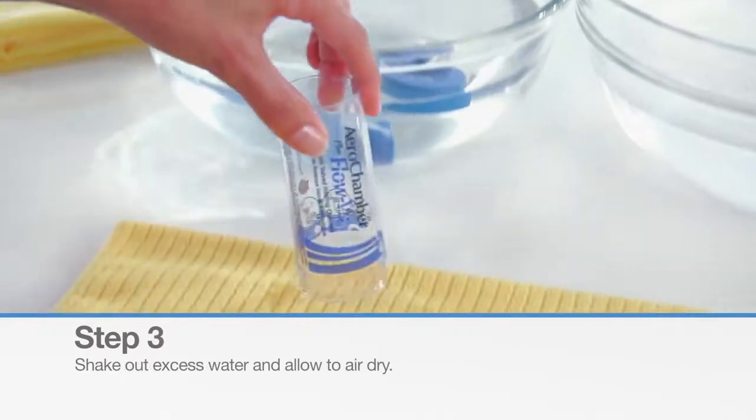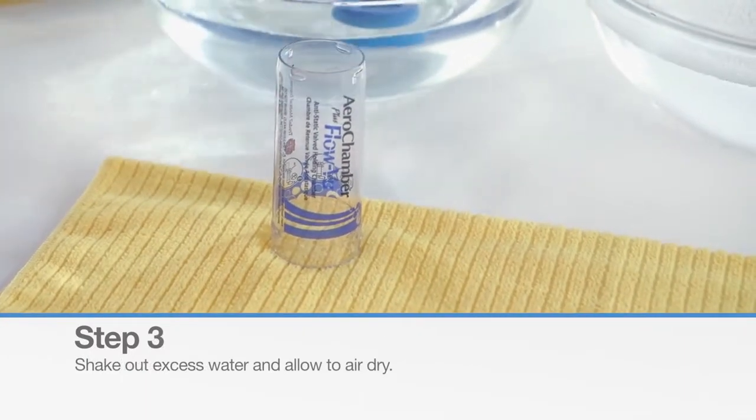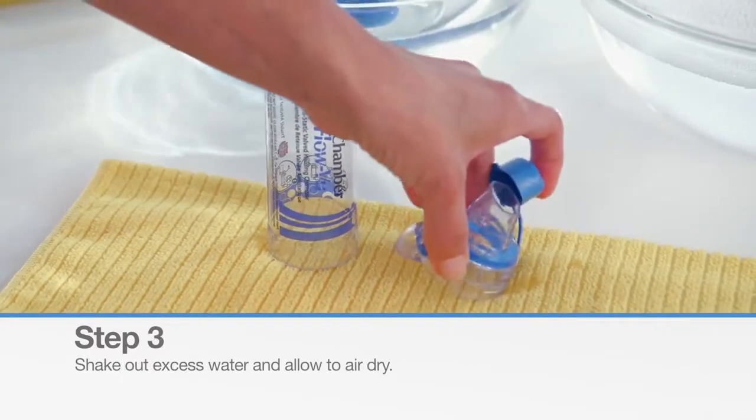Shake out the excess water and allow the parts to air dry completely before reassembling.